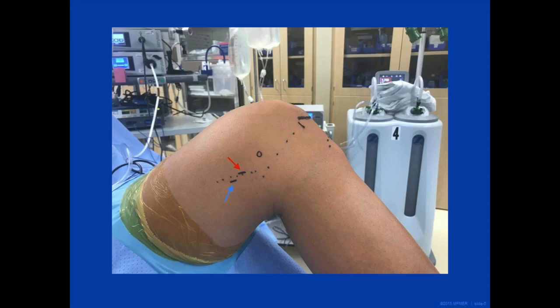A line is drawn in line with the posterior edge of the long axis of the femur centered over the soft spot, and the two portal locations will be created around the soft spot. The first portal is marked 1 cm posterior and 1 cm proximal to the center of the soft spot to create a large enough skin bridge. The second portal is drawn just anterior and distal to that line. Above you see the medial side of the knee with skin markings: the joint line is marked by the larger dotted line, the medial epicondyle is marked with a small circle, the line parallel to the posterior edge of the femur is marked with the smaller dotted line, and the blue arrow indicates the posterior and proximal portal, while the red arrow indicates the anterior and distal portal.